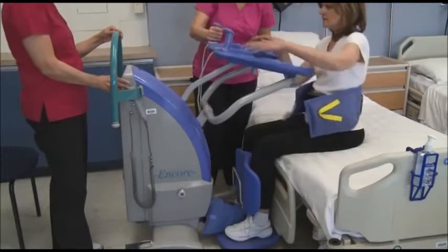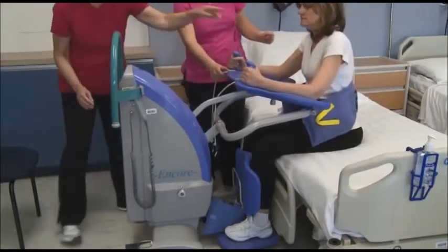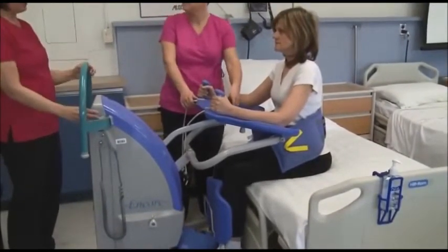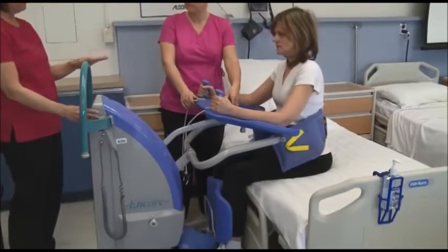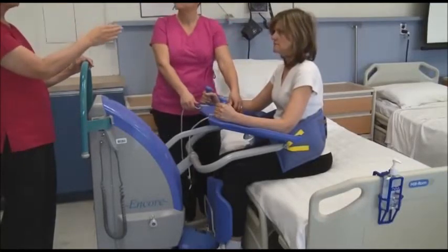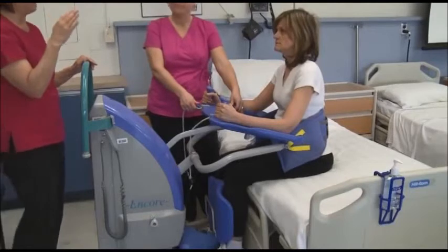Ask you to put your hands up and hold this. It's important to note when we are lowering this that Carmen's shoulders are at a good level and that she's not raising her shoulders up. So actually I think she could probably, it could go down one little bit. Okay? When we are actually lifting our client, it's really important to do steady motion rather than that jerking motion because it can make clients very nervous.